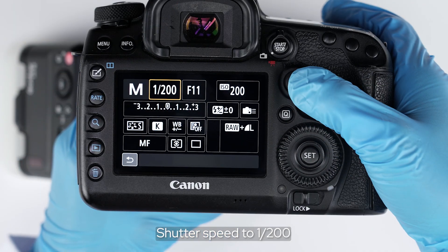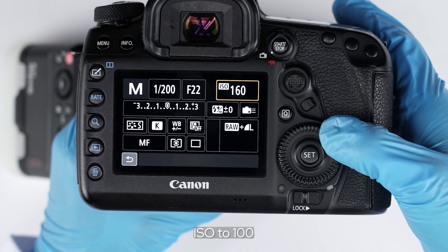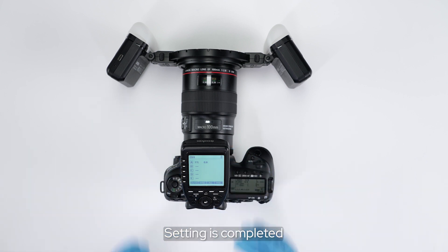Set the shutter speed to 1/200, aperture to F22, and ISO to 100. Test the flash to confirm the setting is completed.